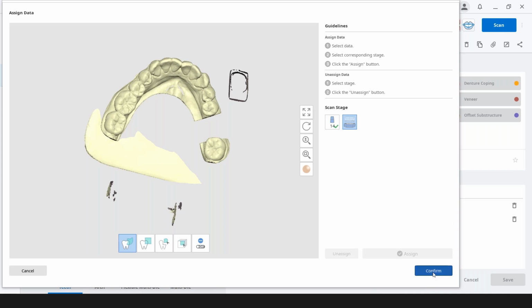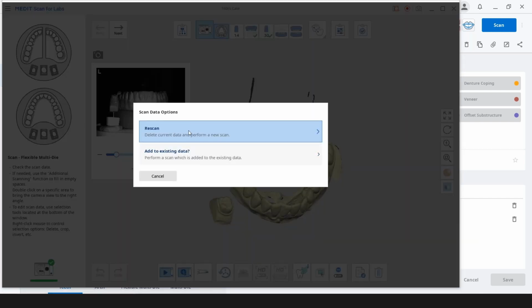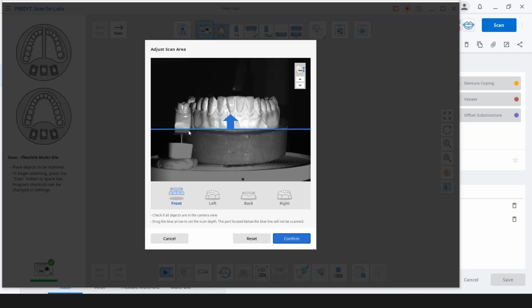So I have to confirm that. So it won't have anything to match up to is the problem. Let me cancel that and rescan that. Well, this is good. It's good to know you can go back and rescan the process, no matter how far you get along. So yeah, I think this is a good part of the learning process.